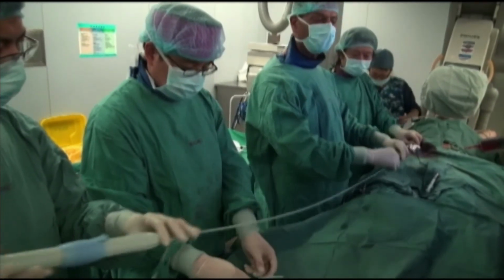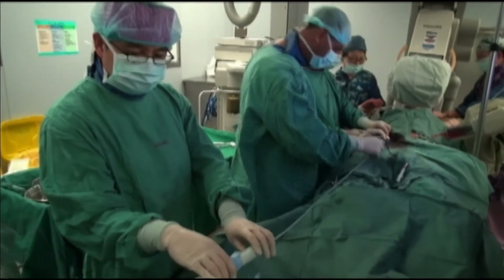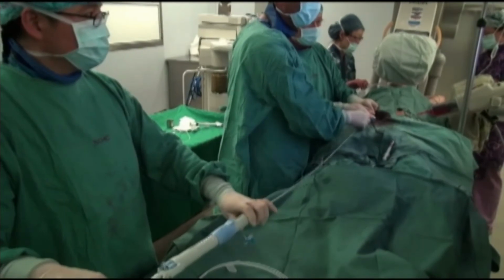25 millimeter length in the straight segment. So the distal part is 1 centimeter, and the proximal part is another centimeter. So the whole valve is about 45 millimeters.